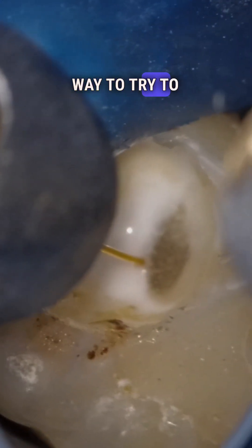Laser-assisted endodontic irrigation is becoming a more popular way to try to be better and more advanced at disinfecting and cleaning the inside of the canals.